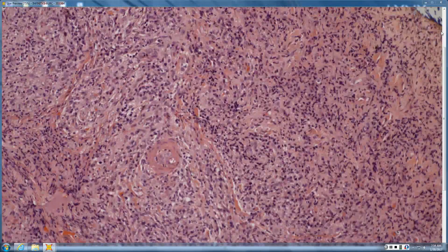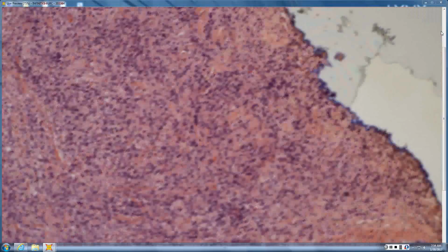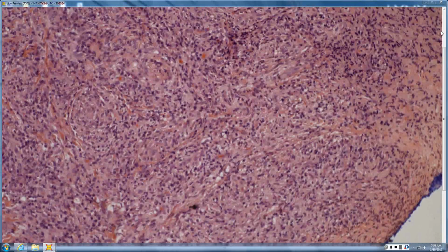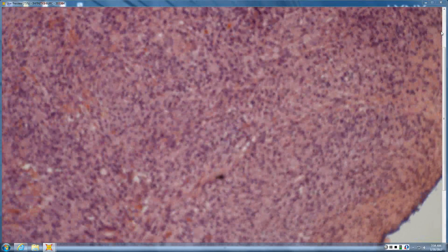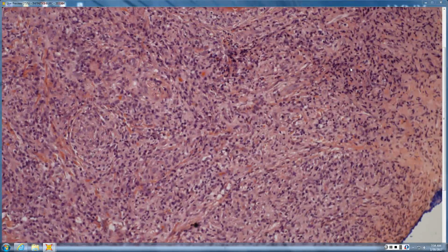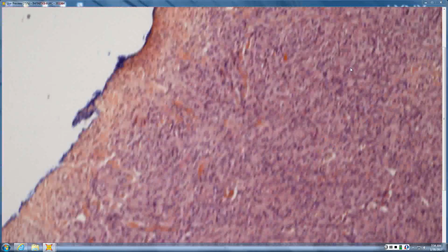I see a ton of lymphocytes, histiocytes. So I'm not seeing many neutrophils. So lymphs and histiocytes, not a ton of neutrophils. I mean, a few. They're probably intravascular and they appear intact. I can't really make out any vessel lumina. Or not many. Yeah, so there's not a whole lot of vessel lumen.